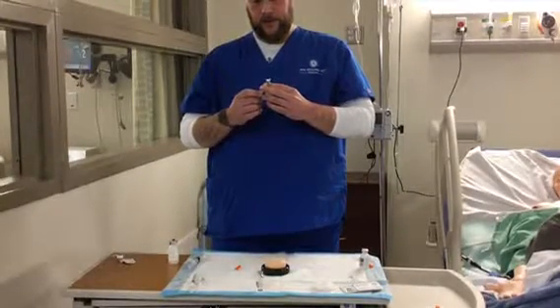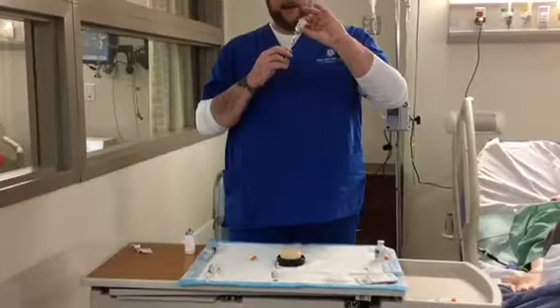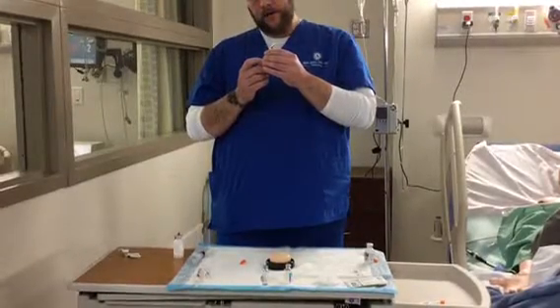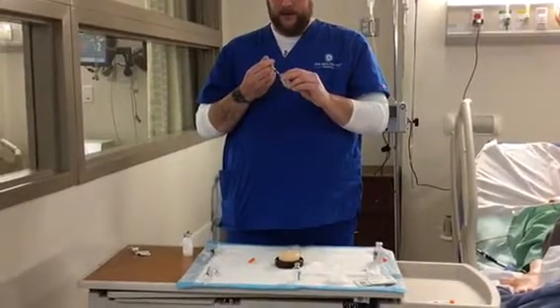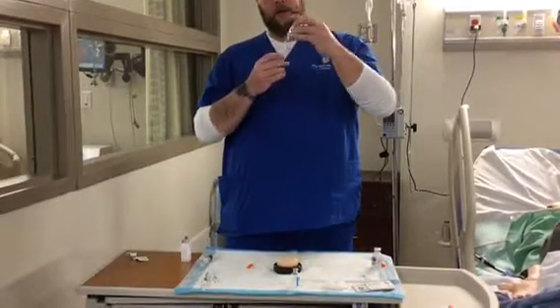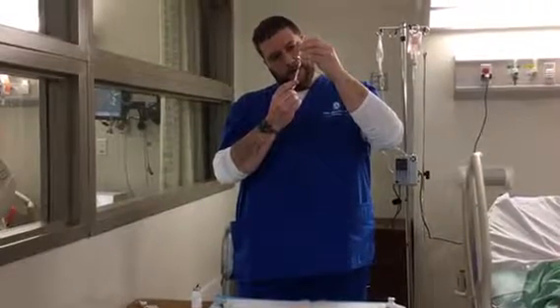So I want to withdraw 10 of air, insert into the vial, and put 10 into the cloudy. Next I'm going to grab the clear, since that's the first one I'm going to be administering. I want 10 units of air. Insert into the vial. Be careful not to bend the needle. Insert 10 of air. Now while I have this out, I'm going to withdraw the 10 of the clear, making sure that there's no air.